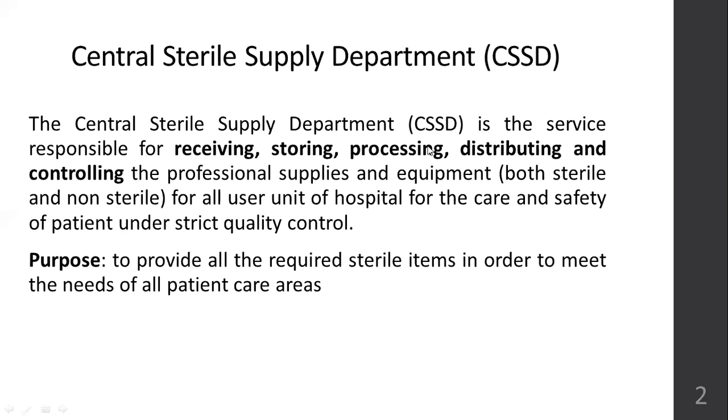So Central Sterile Supply Department, CSSD, is the service responsible for receiving, storing, processing, distributing, and controlling the professional supplies and equipments, both non-sterile and sterile, for all the user units of the hospital for the care and safety of patients under strict quality control. Okay, they have to supply sterile, they receive non-sterile. Okay, receiving, sorting, processing, distributing, controlling. These all are the major functions that the CSSD has to do.